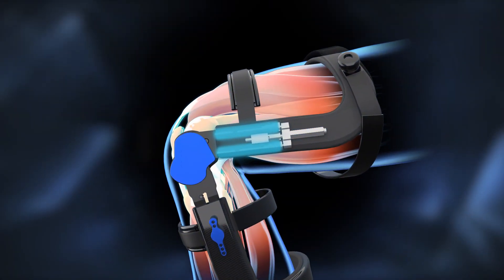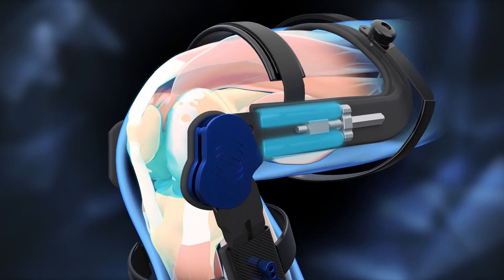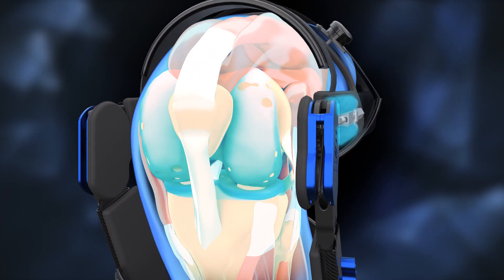Spring Loaded's Tri-Compartment Offloader is the only knee brace capable of simultaneously reducing forces in all three compartments of your knee.